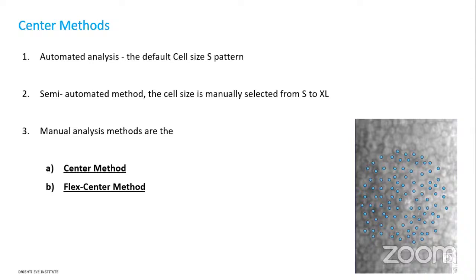And of course, the added feature in the newer, or the 4000 version of Tomey, is the color coding. Like any of our other colored printouts, like Pentacam, a colored visual just gives you a very quick way of analyzing the variation in cell size and shape, because the larger cells will be a darker green and the smaller ones will be a lighter shade of green. So that just gives you a quick analysis of what kind of pattern you are looking at.